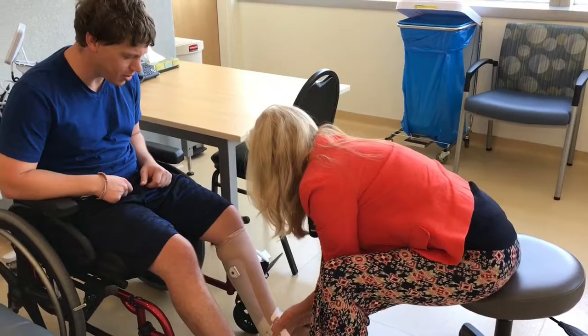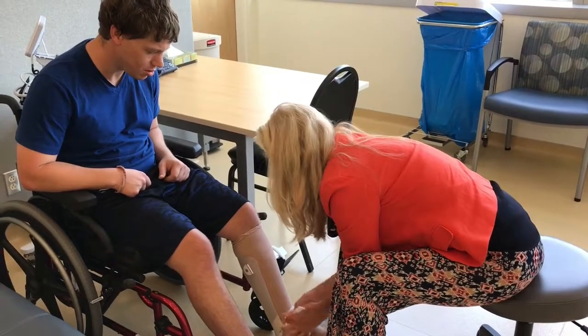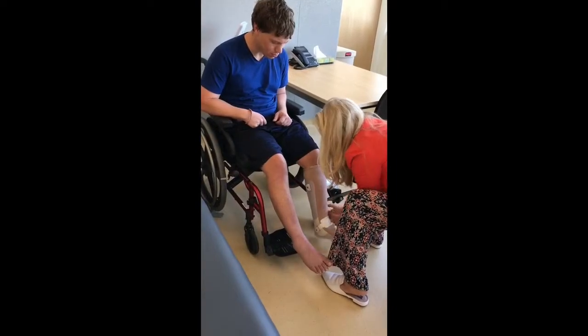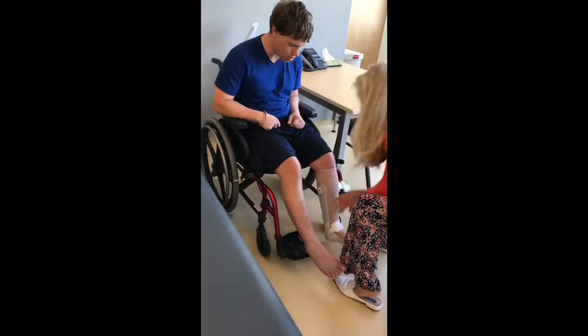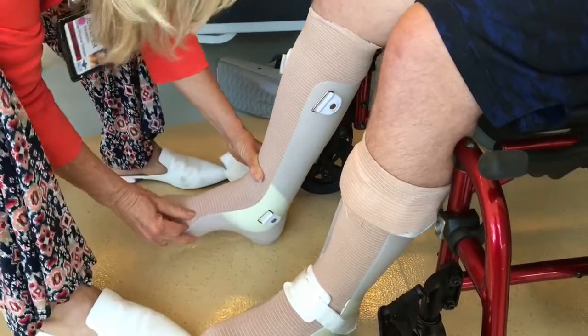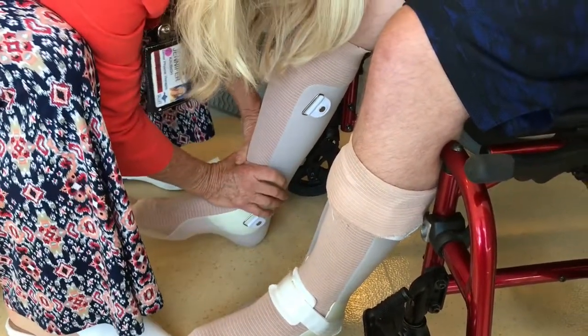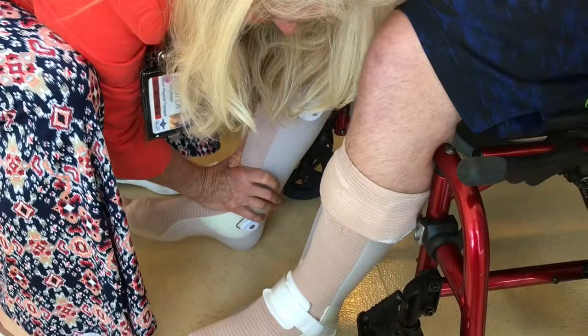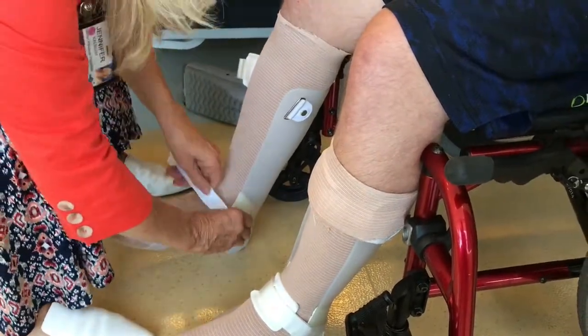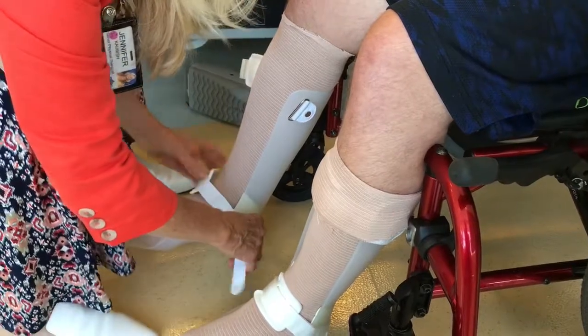It fits really nice. So this is going to strap back into the brace. You don't need to spend a lot on a shoe — the shoe is just going to give you some traction and help keep the brace in place a little bit.